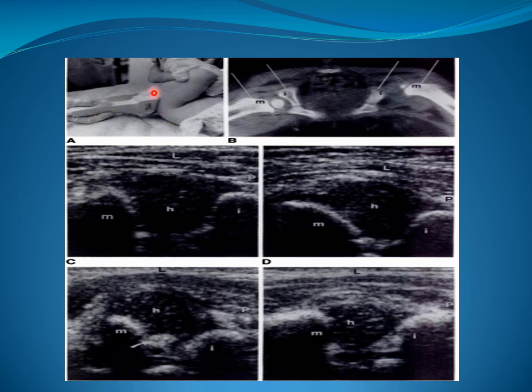This is Barlow's examination, adduction, 90 degrees flexion of hip and knee. We apply the pressure. Regarding the TS view, this is what we see in the CT examination. This is the metaphysis of the femur, the head and the ischium, normal side and the dislocated side.